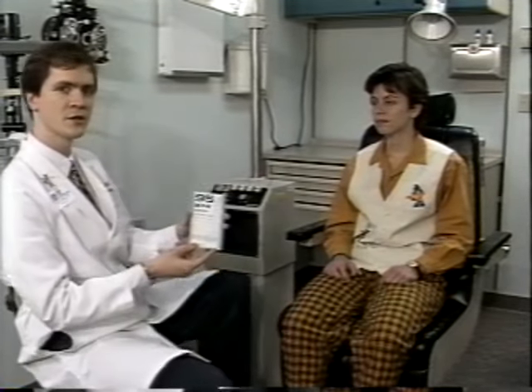ophthalmoscopy. The first step is to determine the patient's level of visual acuity. This is done prior to any manipulation of the eye or shining any lights into the eye. This will give you an idea if there's any visual problems that might need further investigation. To do this, use a near card such as this one.